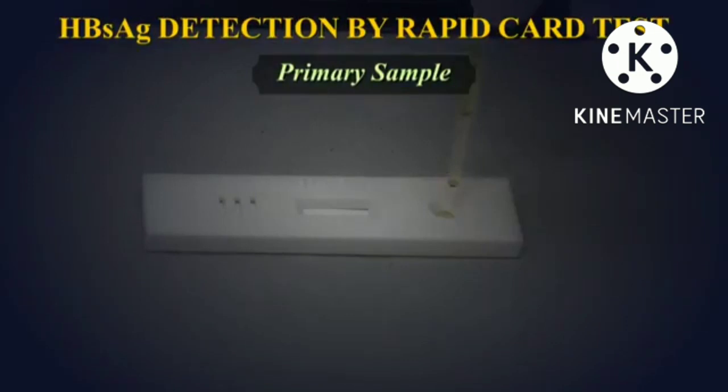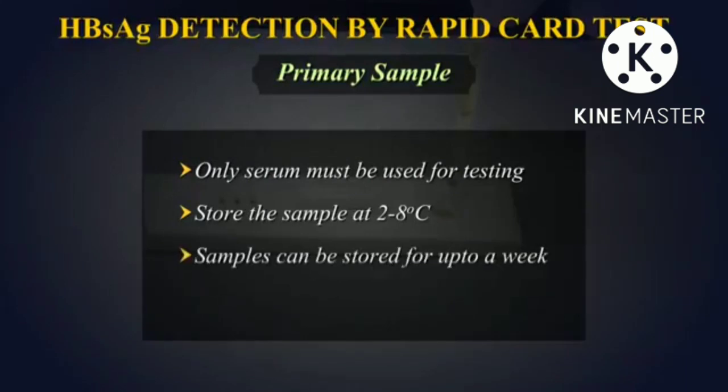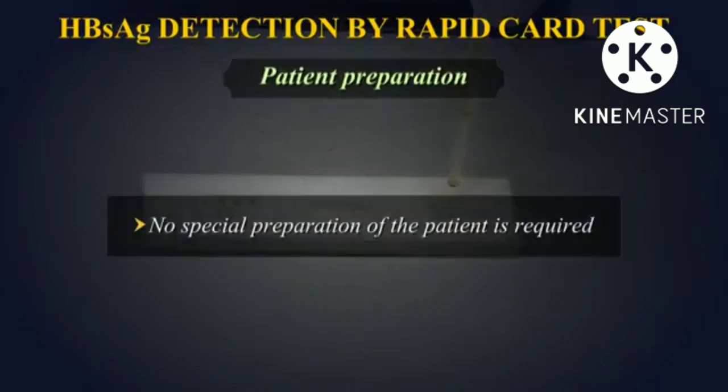Primary sample. Only serum must be used for testing. Store the sample at 2 to 8 degrees centigrade. Samples can be stored for up to a week. Do not use hemolyzed serum. Patient preparation. No special preparation of the patient is required prior to specimen collection by approved techniques.